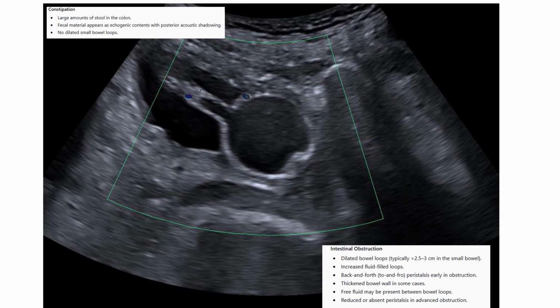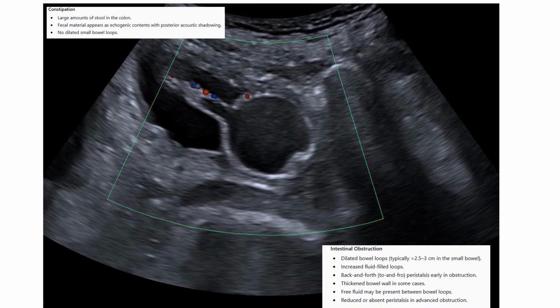What we are seeing nicely here is that there is a catheter bulb in place. This is a very nice catheter bulb, and you can see that there are no hematomas around it, so it's in situ. It is in a normal position. That's the other thing you have to assess when there is a catheter bulb in situ: whether it is in a normal position, and you also have to comment on it because it might be dislodged. I'm super proud of the person who put this catheter bulb in. It's quite impressive. So let's go back to our case now.